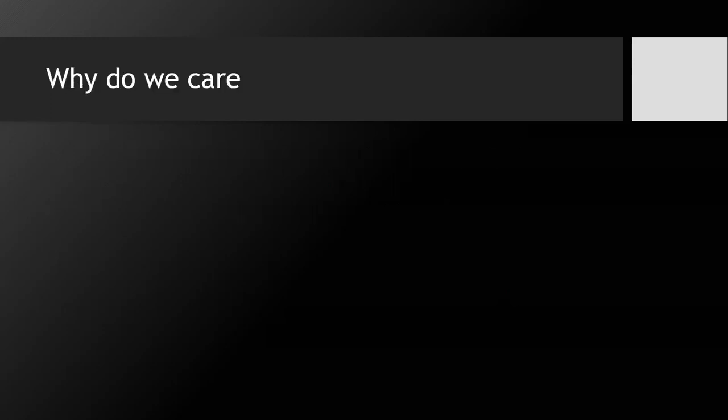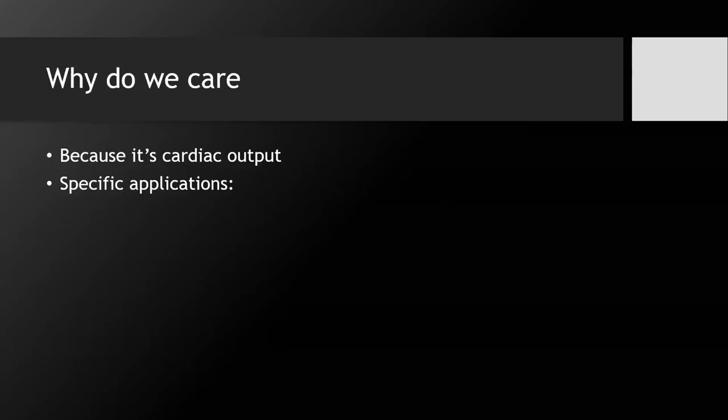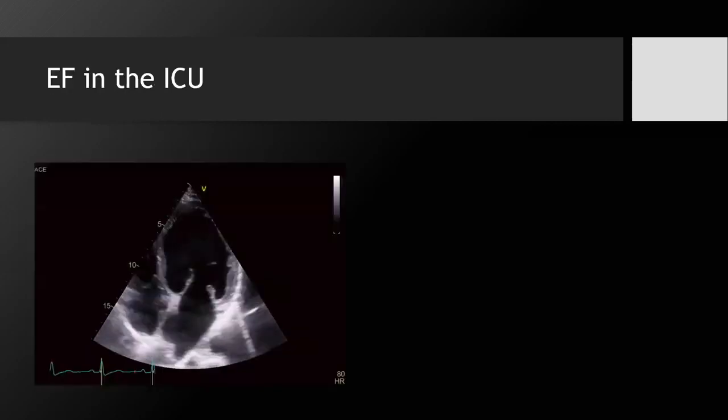All right, so why do we care about quantifying cardiac output on a bedside echo? Hopefully I will convince you. First, it's cardiac output; I think we all just know that cardiac output is important. But I'm also going to try to illustrate several specific applications where cardiac output can help you make a diagnosis that maybe the previous echo skills we talked about in the first LV function lecture could not. So for example, take a look at this echo here.